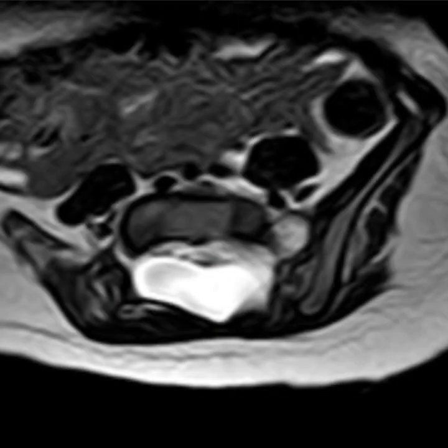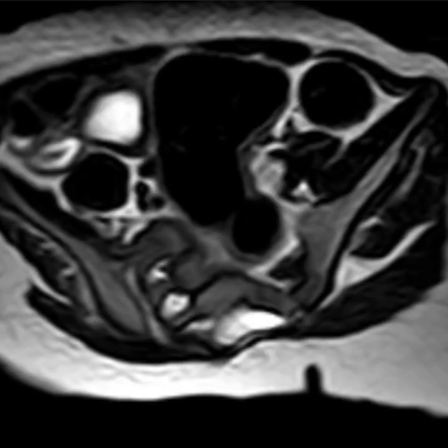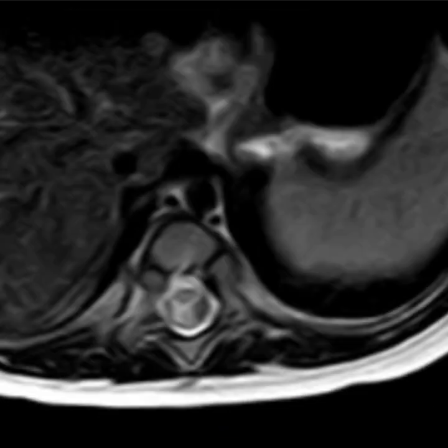However, we can see that there is no sign of any spina bifida aperta. The skin is intact and there is no skin opening. Good job. What else? Probably we can do T2 fat saturated images.